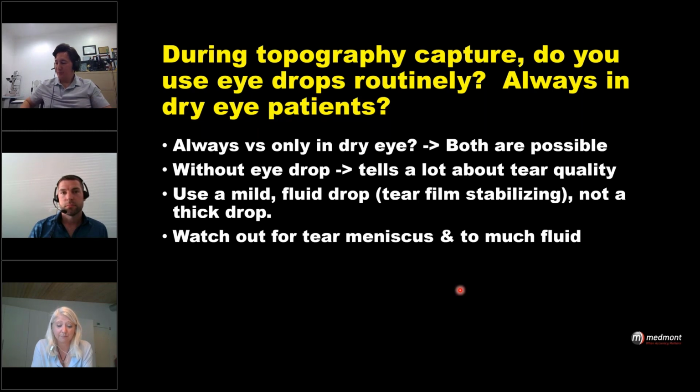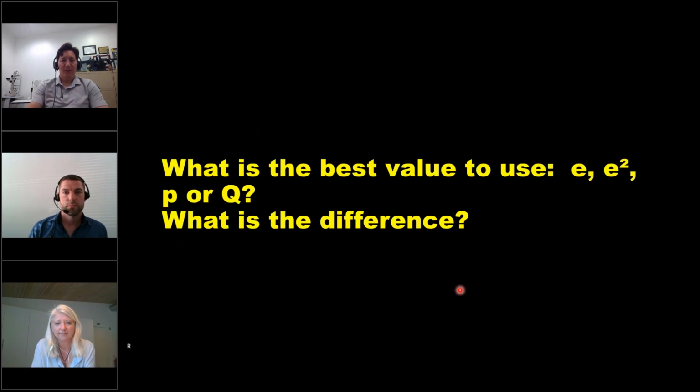Yeah, but I think it's a very good idea with the soft, thin lens that will at least give us a topography we can go on with. But of course, keep in mind that it might change the image a tiny little bit. Makes sense. Well, thanks, guys.